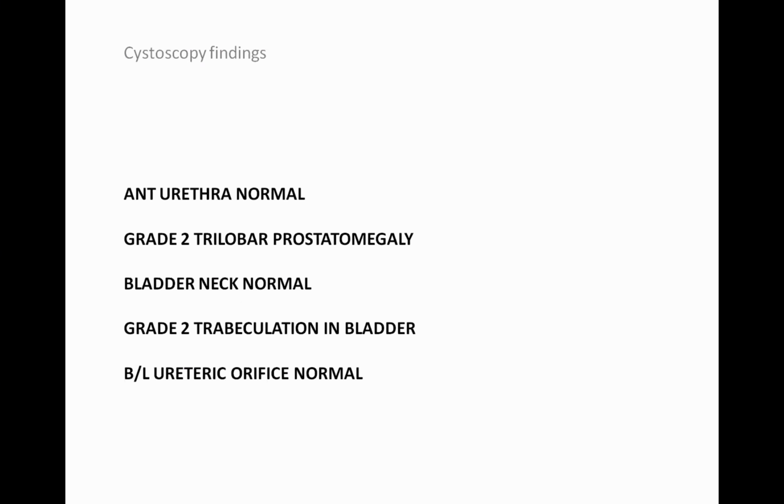Sir, I will be keeping my scope at the veru, sir. Say that. You're saying beyond here, proximal there, you've got definite landmarks. From the veru, all these assessments are made. Yes, sir. Yes.